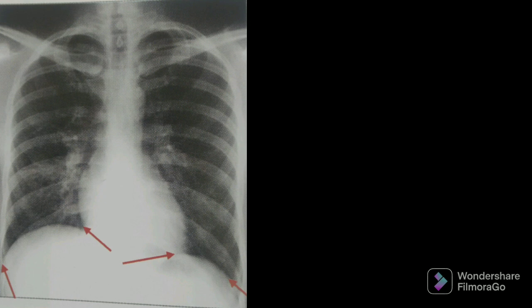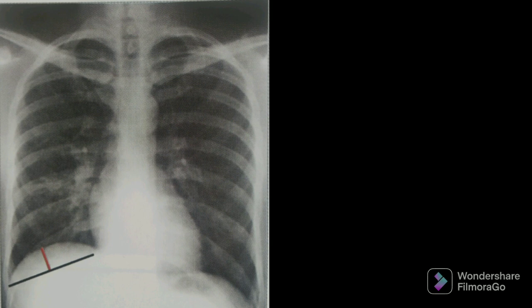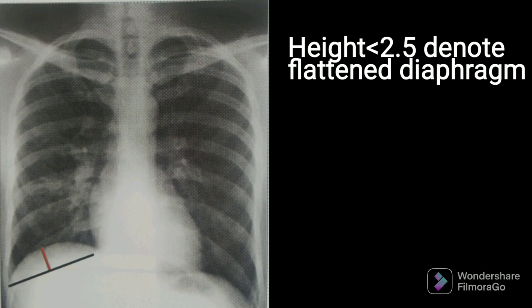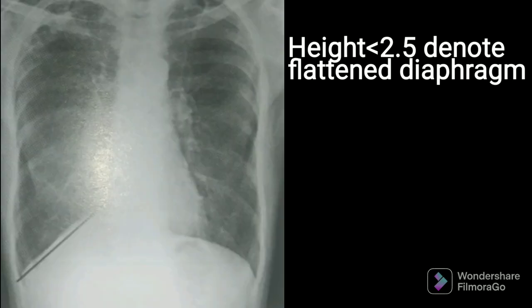When do we say the diaphragm is flattened? In a normal diaphragm, we draw a line joining the costophrenic angle and cardiophrenic angle, then draw a perpendicular — shown by a red line — from the center of the dome of the diaphragm to this line. If this distance is less than 2.5 cm, it denotes a flattened diaphragm, as seen in this image.